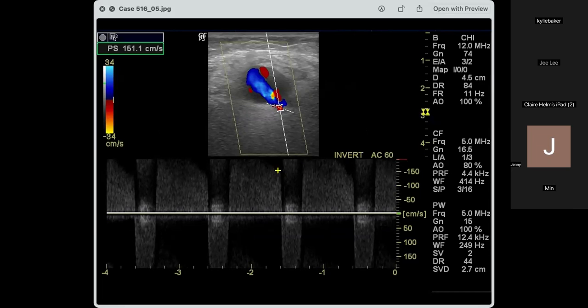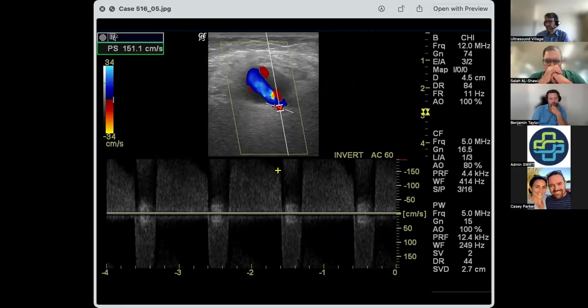Showing biphasic flow, predominantly towards the Doppler angle. One thing you've got to be a little careful on is that the machine is inverted. For some reason, when this machine was trying to automate measurements, it would decide which way up it should be and would often flip it. So it is a little confusing. This is actually the flow towards the probe, and this is the flow away from the probe. That makes more sense. Pulsing in and then slowly emptying out.